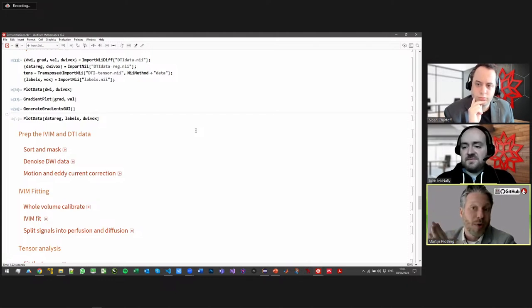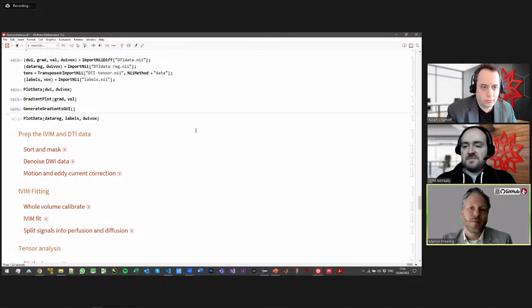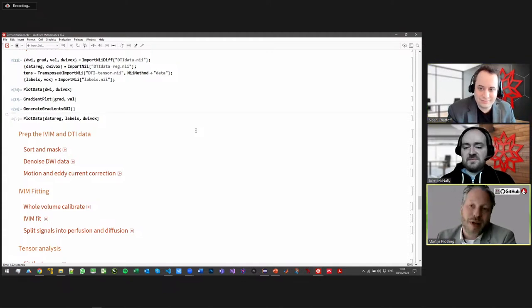So we have an anisotropic part of the signal, so we can also quantify that, and that's what we call FA then in that case. So we can also imagine that if cells start to get smaller, then there's more restriction perpendicular to it. These kinds of things we typically look at. We also can do something called fiber tractography, where we actually can generate a 3D representation of muscle architecture. I'll show you an example later on of that. You can design these experiments to be sensitive to different aspects.